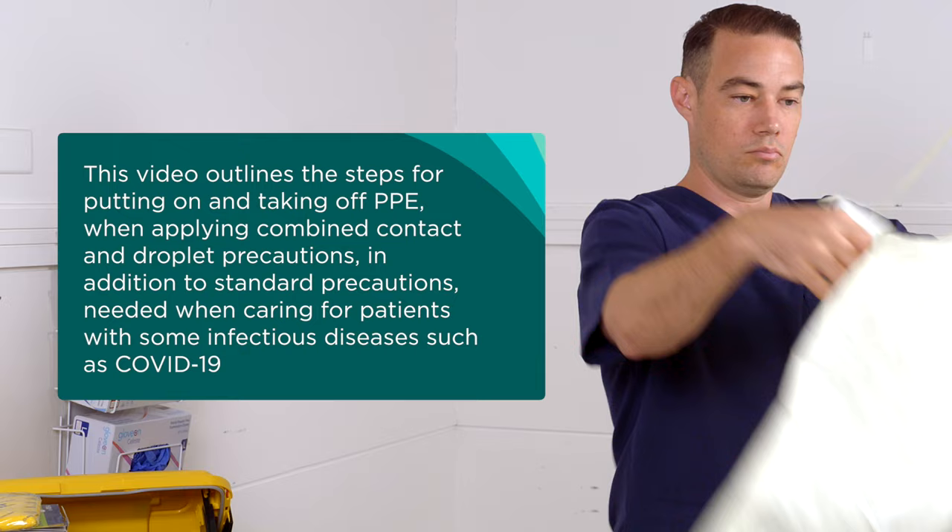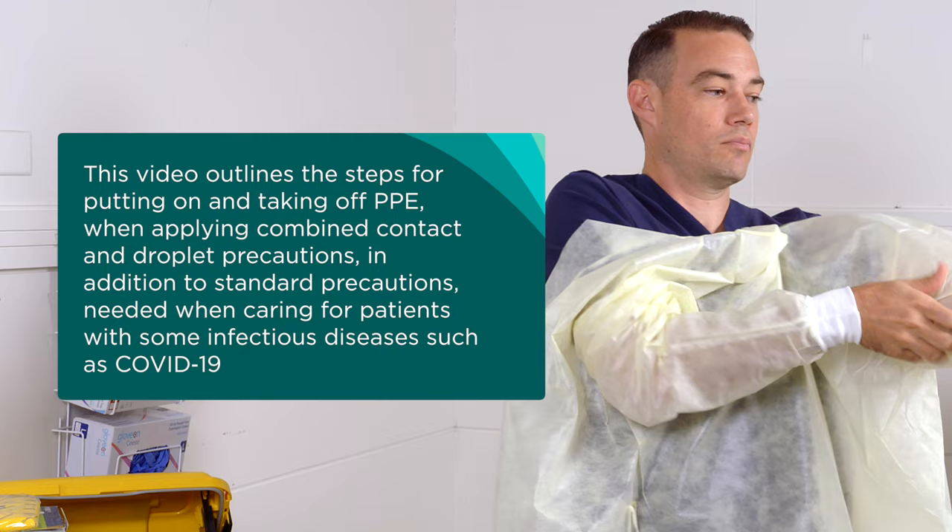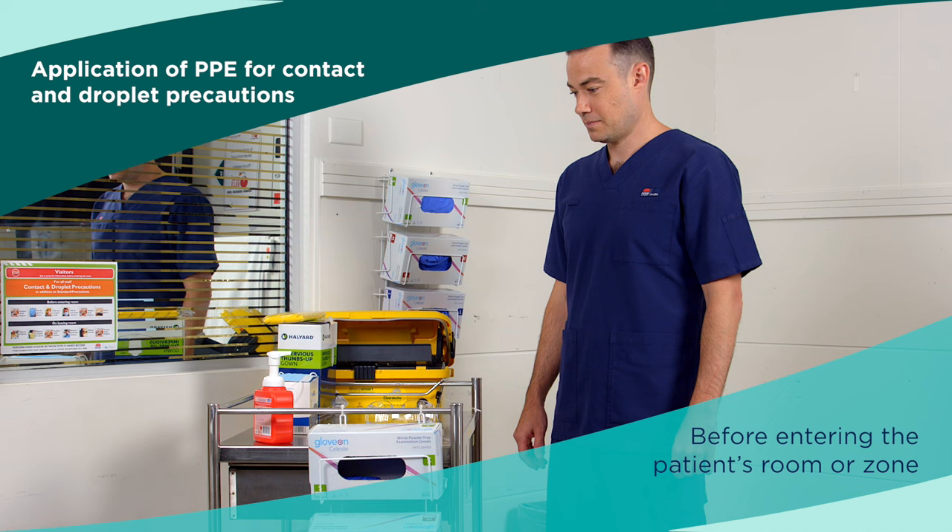This video outlines the steps for putting on and taking off PPE when applying combined contact and droplet precautions, in addition to standard precautions needed when caring for patients with some infectious diseases such as COVID-19.